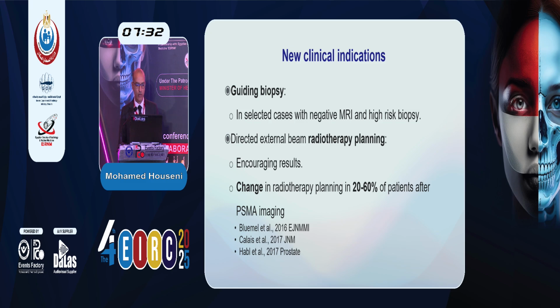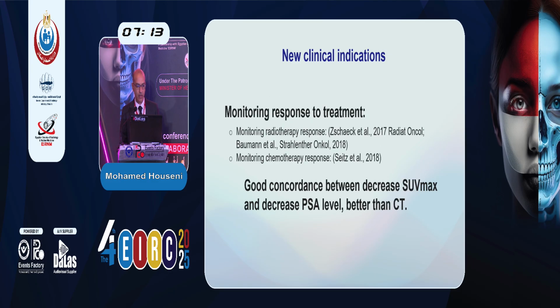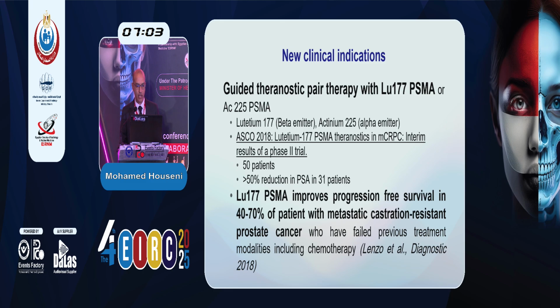Now, if you are talking about the new clinical indications, guiding the biopsy toward the most active lesions in the prostate, also it's helping the radiotherapy planning, with a change in the radiotherapy planning ranging from 20 to 60% in patients by using the PSMA PET-CT. And new clinical indications, including monitoring response to therapy, there is a good concordance between decrease in the SUV max and decrease in the PSA level, better than CT.